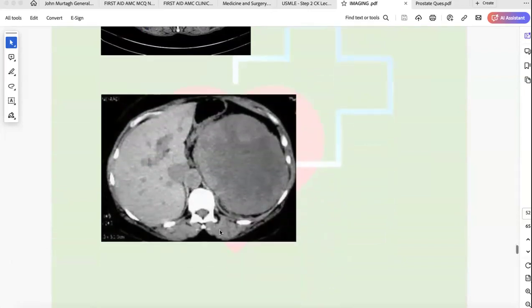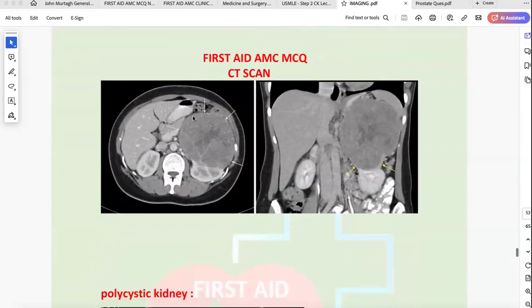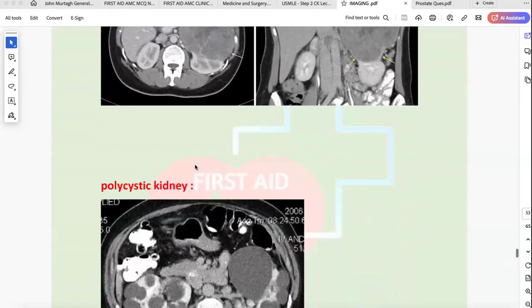Same on this side, definitely the right kidney is still not visible because it's mainly liver side, but the left kidney, because it's a large cancer, even you can see it now. This is the commonest one that you can see. So you can see the right kidney, the left kidney, that's how big the cancer is. Okay.